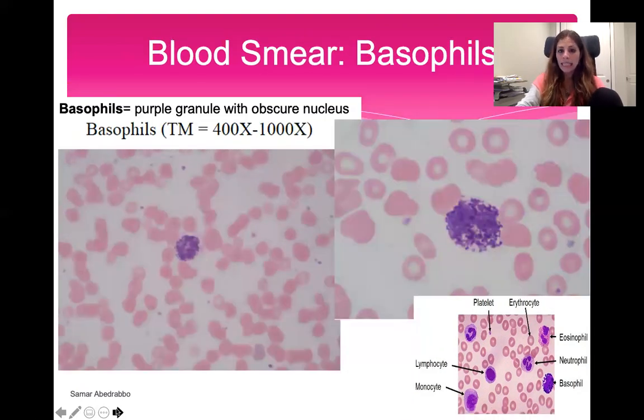Basophils are the least common type of white blood cell, or leukocyte, and they have a lot of granules. Remember, basophils play an important role in inflammation, and those granules are histamine that you see here. We'll learn about this later, but when someone has an allergy attack or a different type of infection that causes a lot of inflammation, these basophils release the histamine. So this is what basophils look like. They're very granular. I think they're the easiest to identify because they look very different.